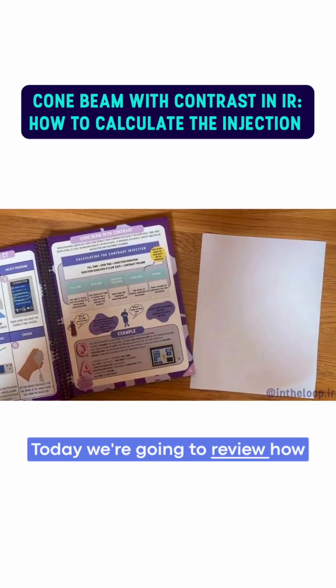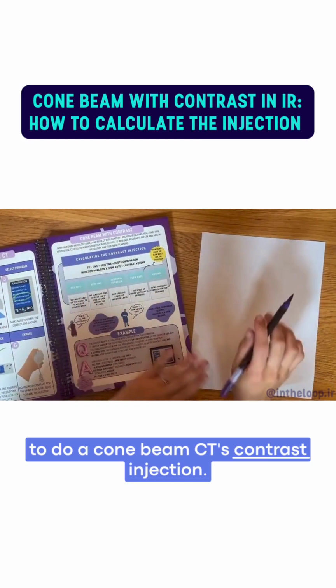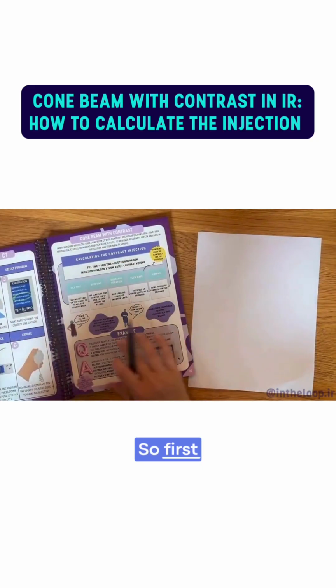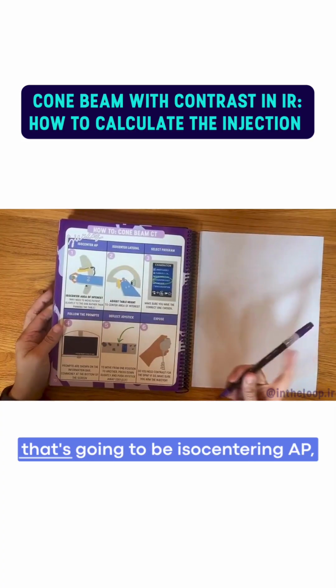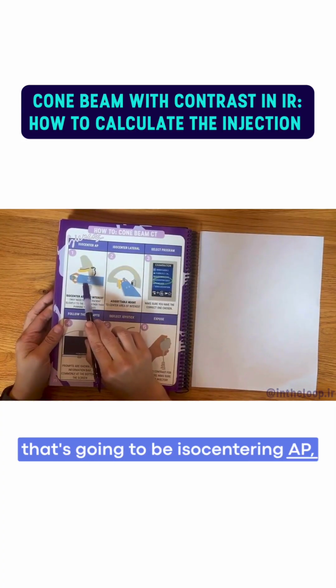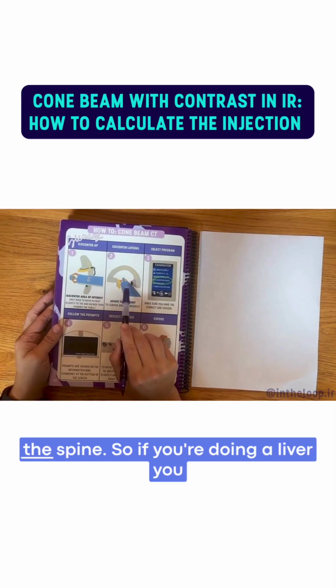Today we're going to review how to do a cone beam CT contrast injection. First things first, you're going to acquire the cone beam. That's going to be isocentering AP, isocentering lateral, and you're doing your region of interest. You're not centering the spine.